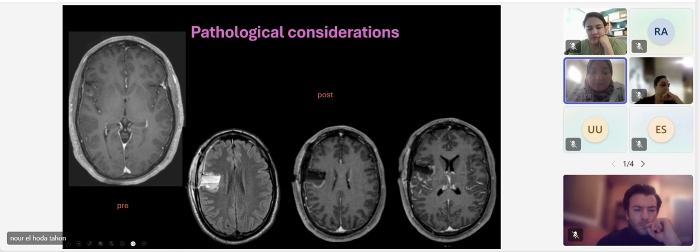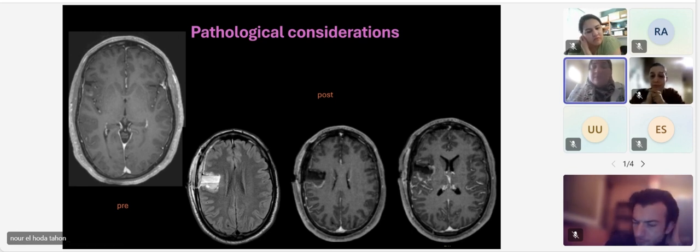It's hyperintense, as you can see here. There's some subdural hemorrhage here, and all of this is expected. Even if you see some thickening, if you look at the immediate images after the surgery, you can say these are expected post-surgical changes. But once the patient has a follow-up after 3 months or 6 months, and you still see the same findings, this is probably a tumor.